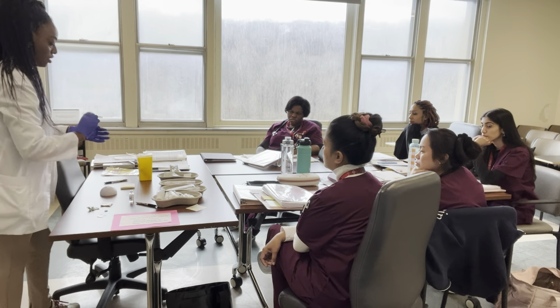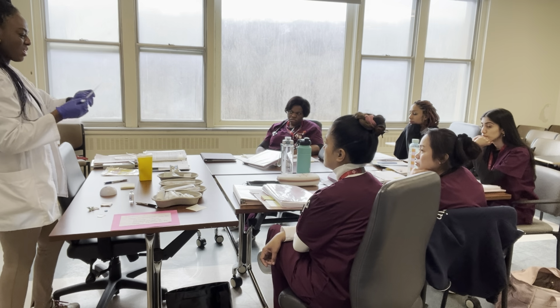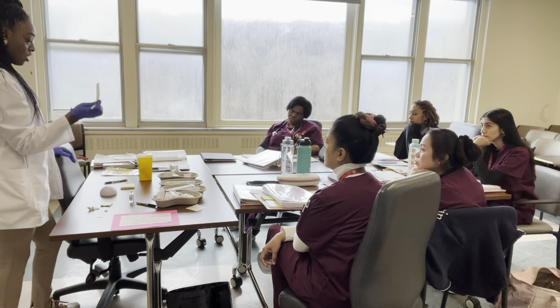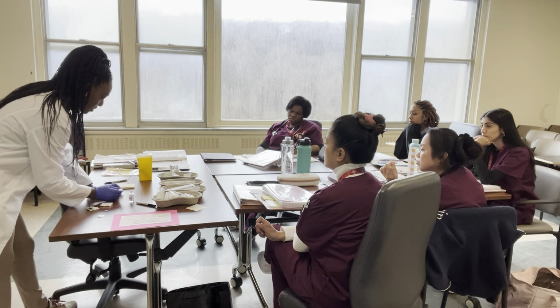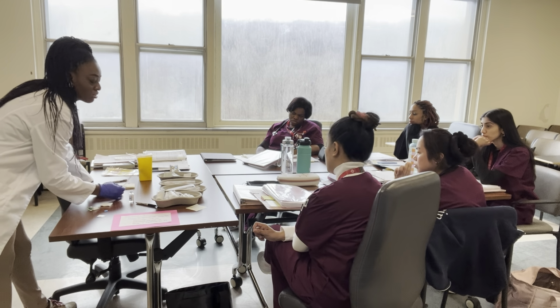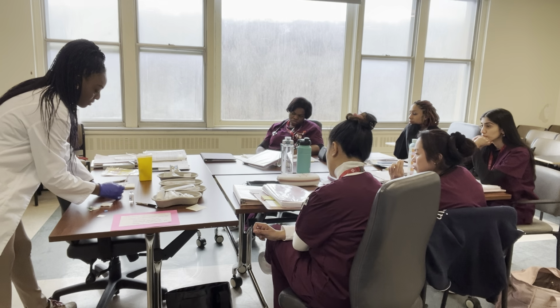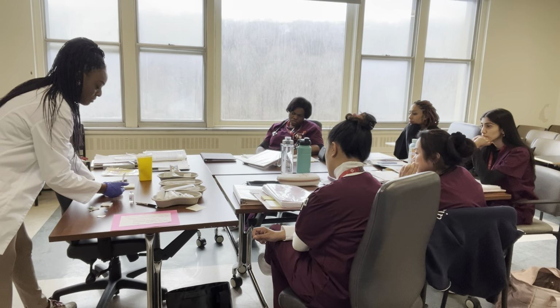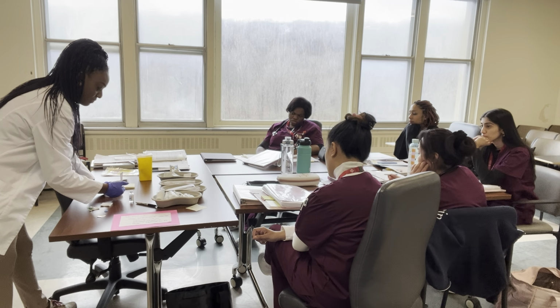And then you remove the cap. Some people are struggling to remove the cap. Sometimes you can twist it and pull. I hold it like a dart. I go close to where I'm going to inject. And then you can let the person know, I'm going to go on 3, 1, 2, 3. And then don't inject hard, just a nice little slow insertion of the needle. Then you inject with the thumb on the plunger, slowly.